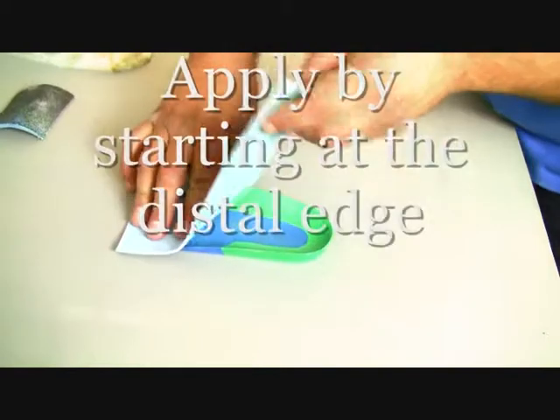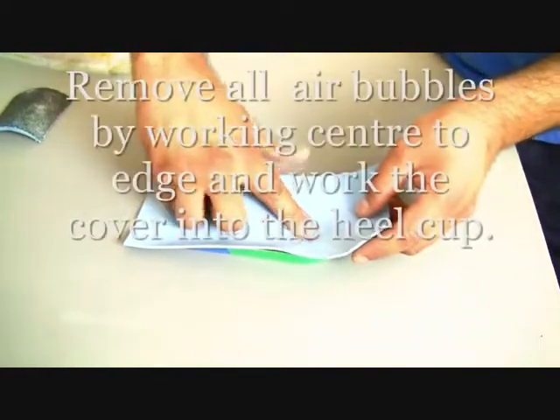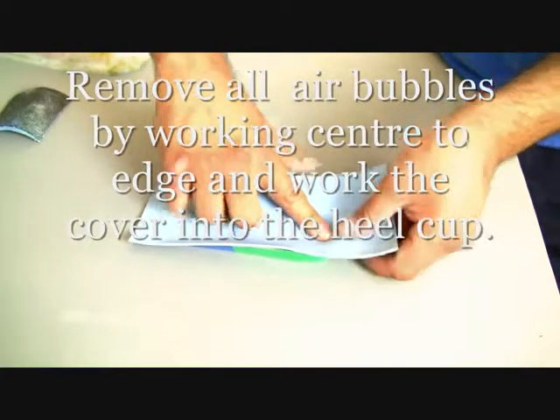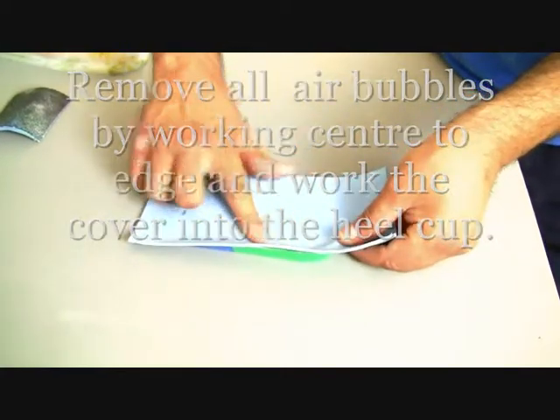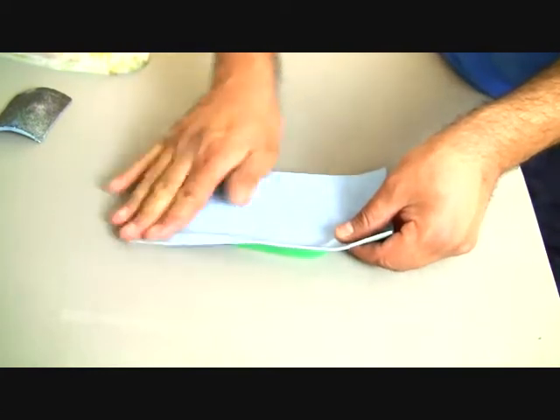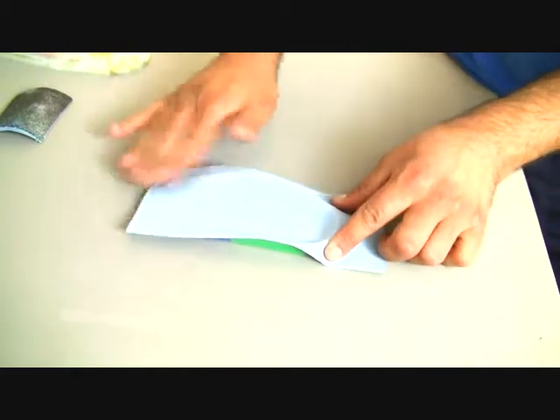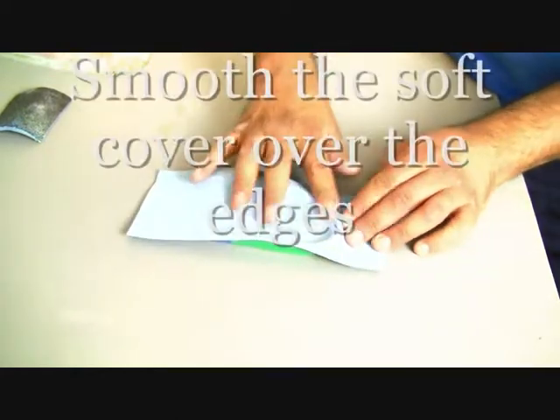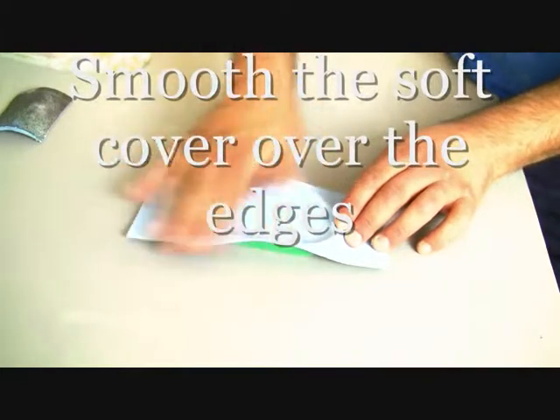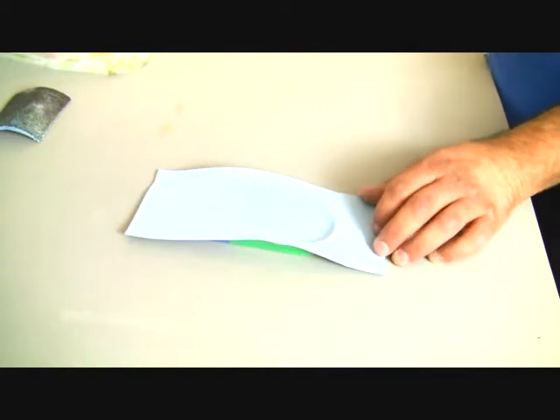Commence applying the cover to the distal edge and work back towards the heel cup. Note that the technician is easing the cover into the heel cup. The technician is ensuring that there are no bubbles underneath the cover and that the edges are completely glued down. Note how he is running his finger around the edge of the orthotic to ensure that there's a good fit to the cover.